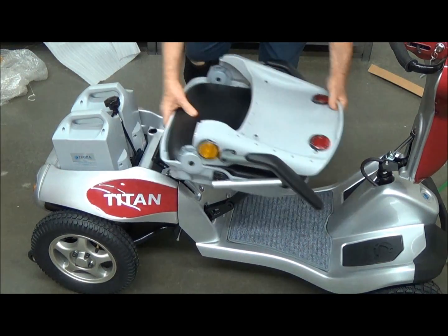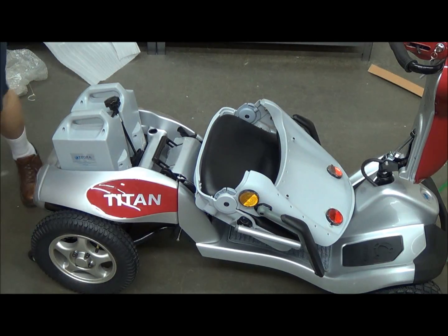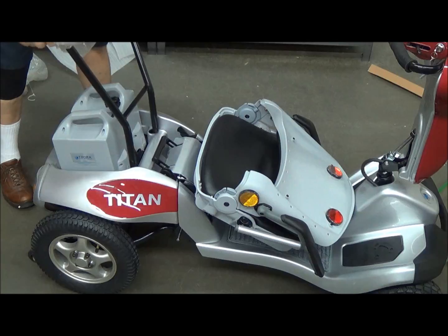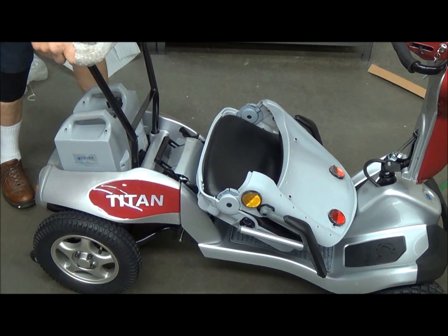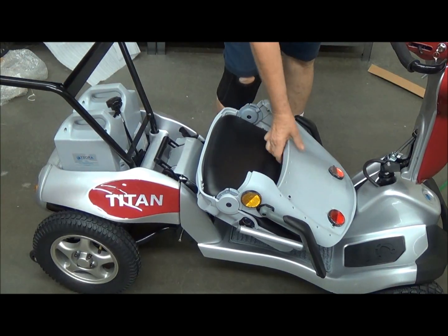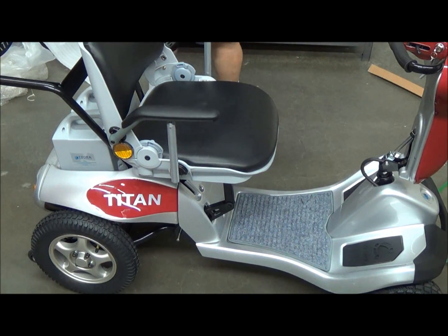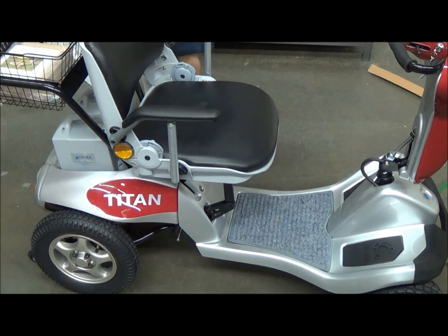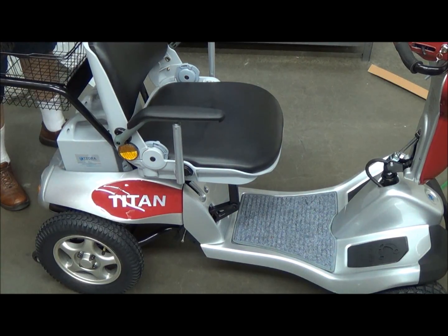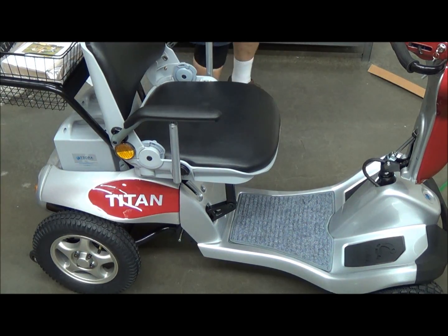Next, you need to put the seat down in order to put the basket frame on — it just isn't quite enough room otherwise. The basket frame rack slides right into those two holes, and then you put the seat back up. Then the basket just fits in there just like that. You've got the owner's manual, you've got the charger, you've got a rear view mirror. And it's just that easy — thank you.